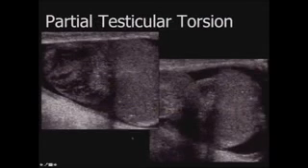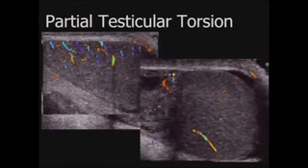So in this particular case, certainly not a normal ultrasound appearance. There's an abnormal lie of the testis in this longitudinal view of the scrotum. There is a paratesticular mass. And when you turn on color, the asymptomatic side has a lot more color than the symptomatic side. I will tell you these waveforms looked exactly the same.